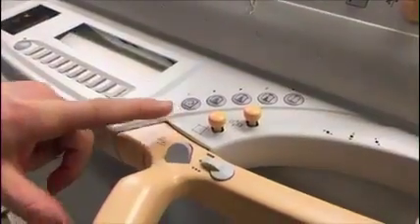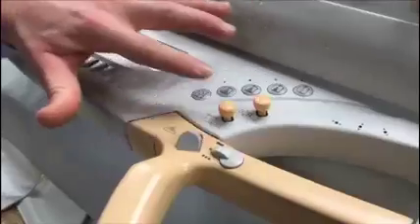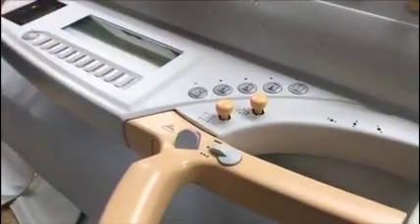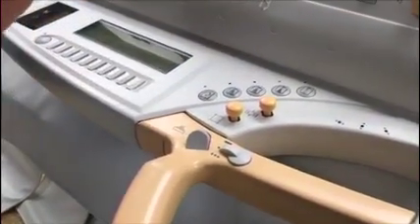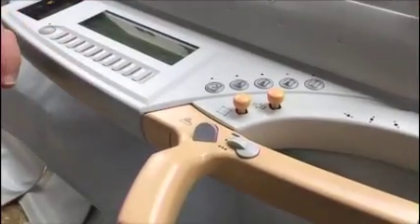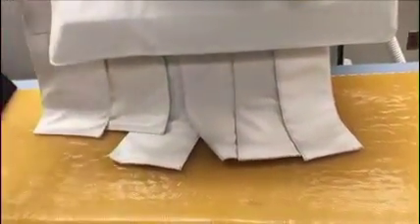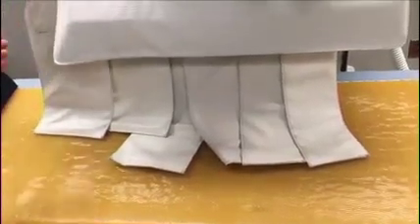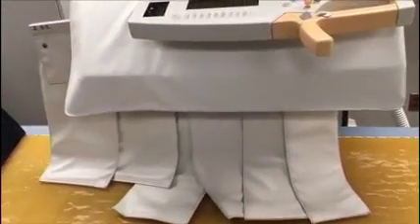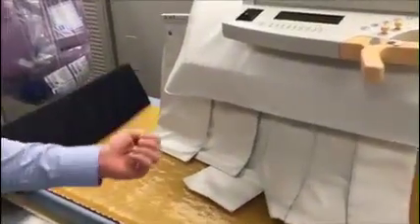Here's our four-way control for collimation, so you're going vertical and in horizontal direction to minimize and focus in on the anatomical area of interest for the procedure. Below, we have lead drapes, which again, the patient will be inside of the drapes, but this is going to minimize scatter and decrease absorption to the surrounding healthcare professionals.